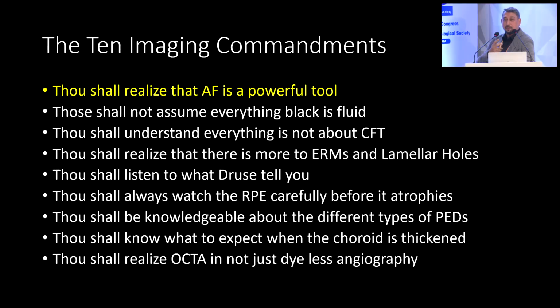Change of pace over here. We're just going to go a little bit into the medical management and a few OCT features in a very simple presentation. So we call it the 10 Commandments, okay? So the first, we're going to say that kindly realize, thou shalt realize that autofluorescence is a very powerful tool.